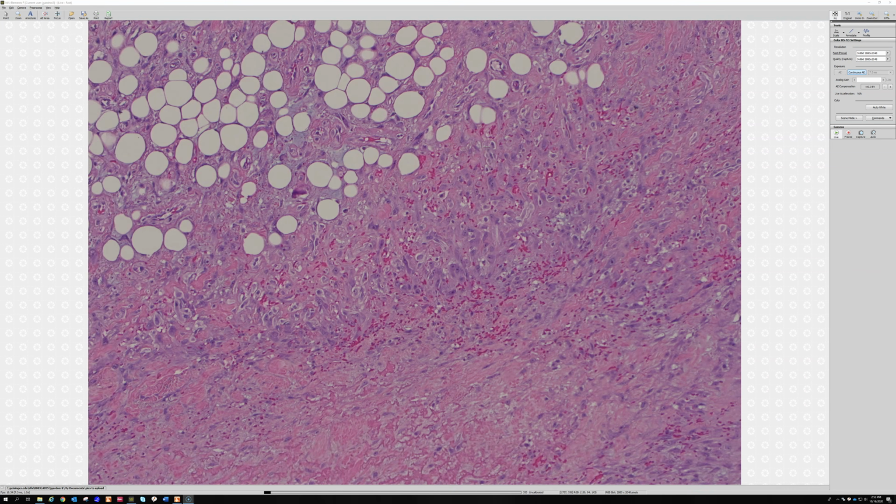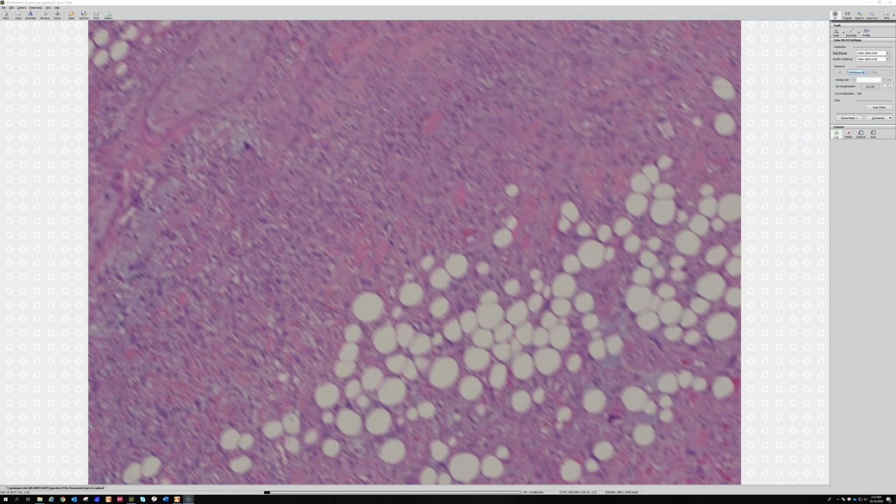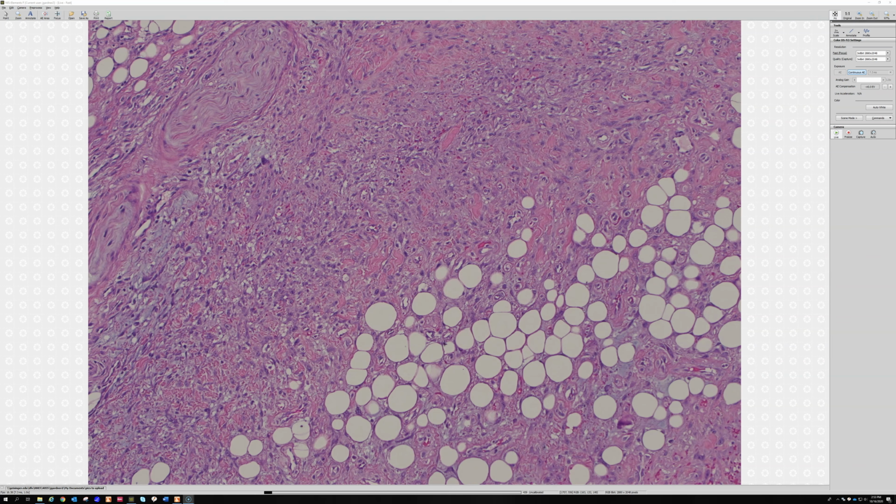So these can be large, and so clinically they can be concerned that this is going to be a sarcoma, especially if they don't actually have a decubitus ulcer over it. It's just a mass underneath. So the surgeons will often be worried that this is a growing mass, and because it can be kind of large, they will often be concerned that it's a sarcoma. So this is one of those times it's scary looking microscopically, and then clinically their concern is for malignancy.